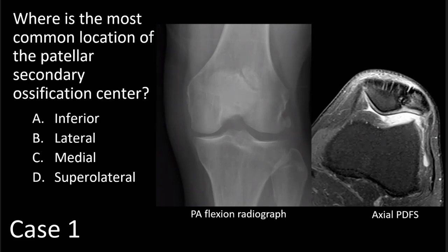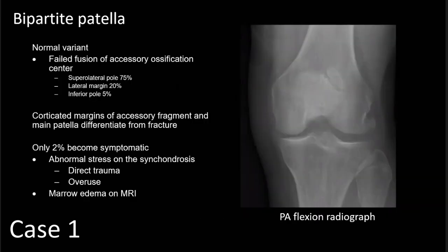There's also only minimal edema within that lateral bone segment. The question in this case is: where is the most common location of the patellar secondary ossification center? Inferior, lateral, medial, or superlateral? The answer is superlateral, which is the location seen in this case. This is a case of bipartite patella, a normal variant characterized by failed fusion of an accessory ossification center, most often at the superlateral pole — 75% in that area — although it can occur along the lateral margin in 20% and more rarely along the inferior pole in 5%. The corticated margins of the accessory fragment and the main patella help differentiate this entity from fracture.